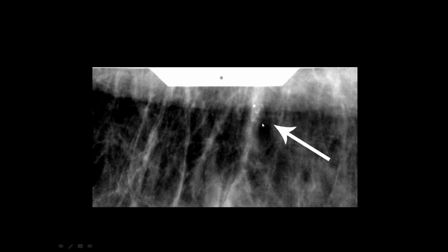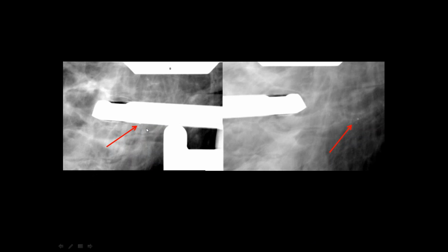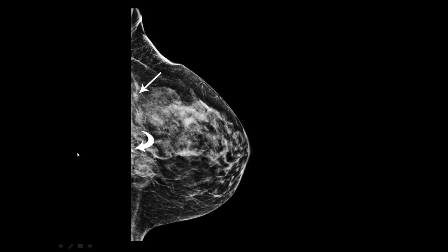And we tried to do a prone biopsy, and you can see they're not very well defined, but we can see them well enough. This is the tabletop right here. And try as we may, we could never get the needle right. And we did a biopsy anyway. Turned out we didn't get calcium. Here's our clip. It's not in the right place.